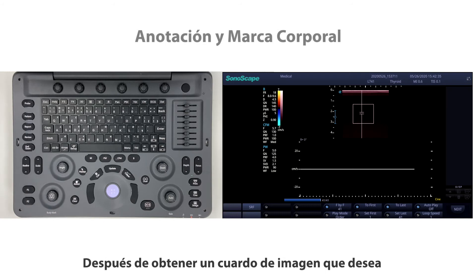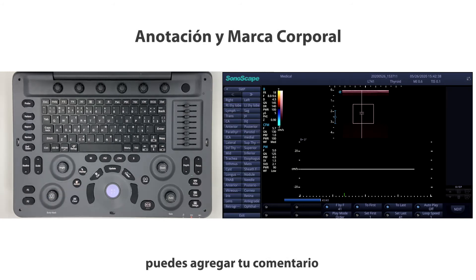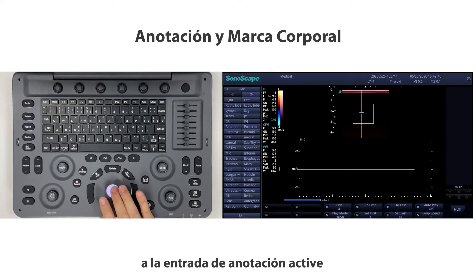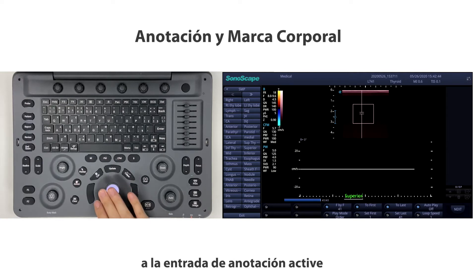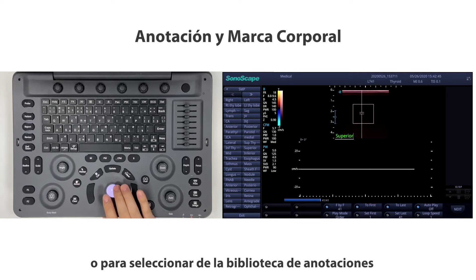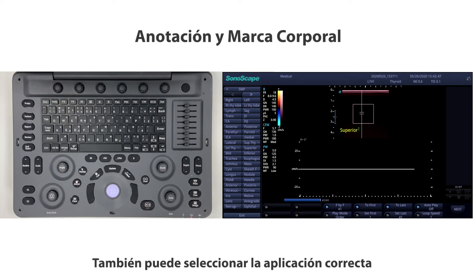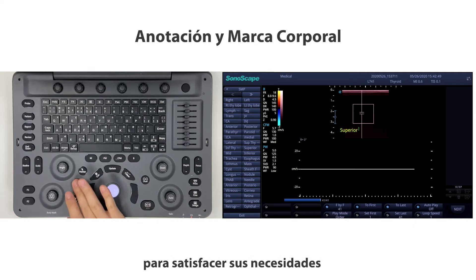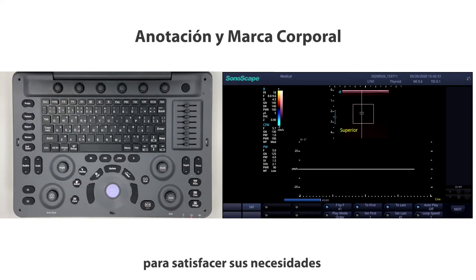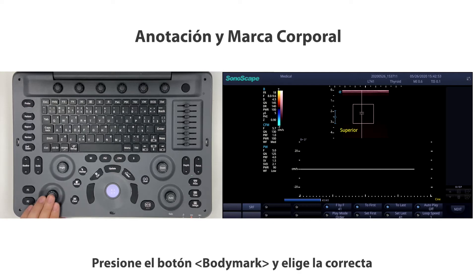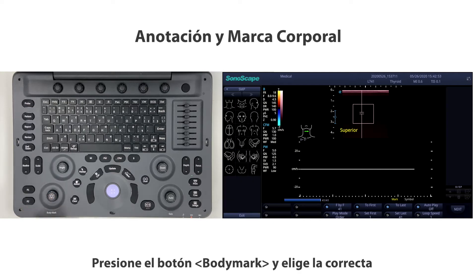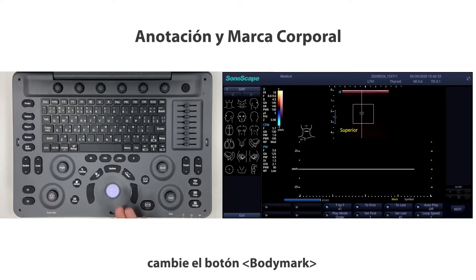After you get a frame of the image you want, you can add a comment by pressing the annotation button below. You can select the right application to activate annotation input or select from the annotation library, choosing the right application to fit your needs.